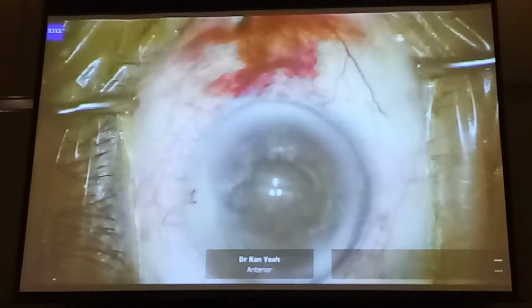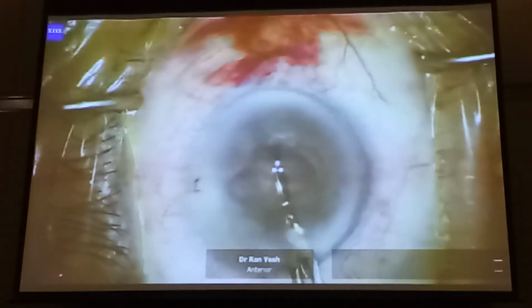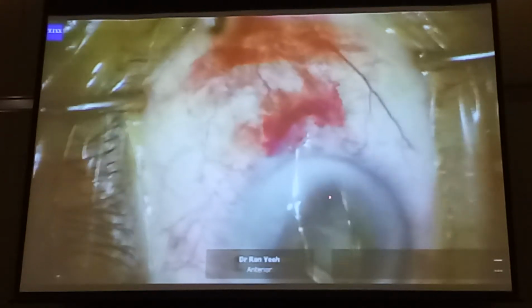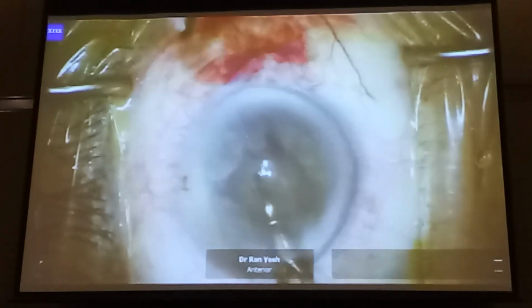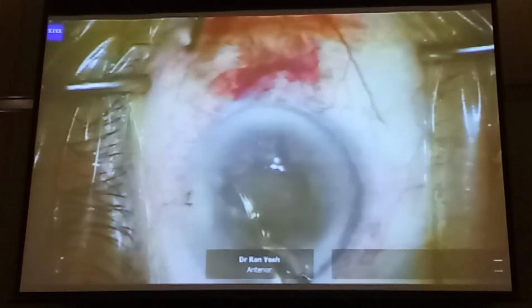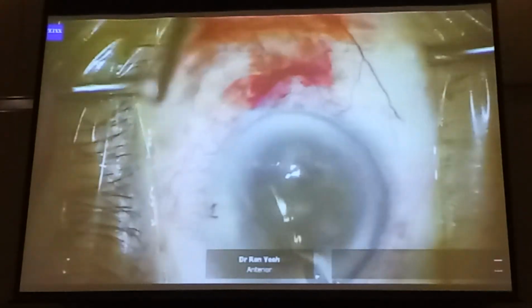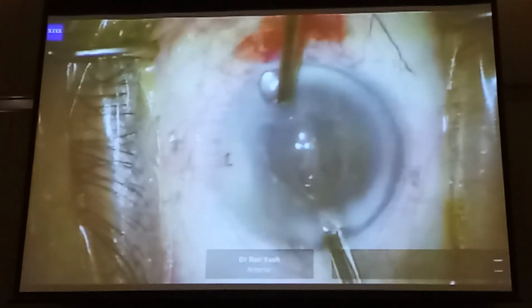And I thought, well, maybe I'll just use the pre-chopper and see if it can just help me complete the cracking. So I put in the pre-chopper, just get enough nucleus there to do a pre-chop there. And remember, she had another little chop there. So that was enough, just by doing that, to free up that fragment enough that I could then go back in and pull that nuclear fragment out. See, I didn't need to do very much.